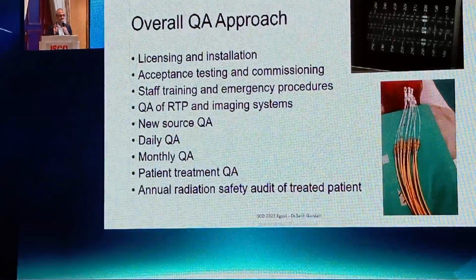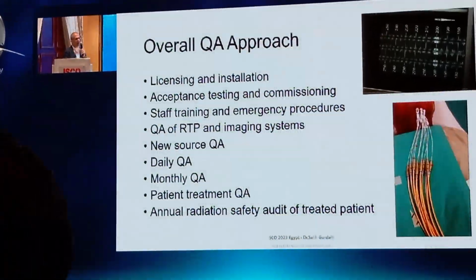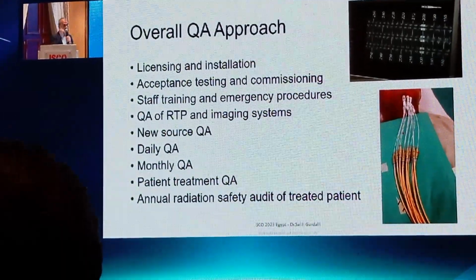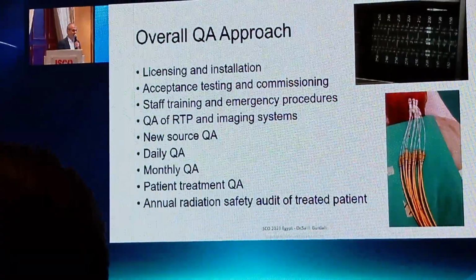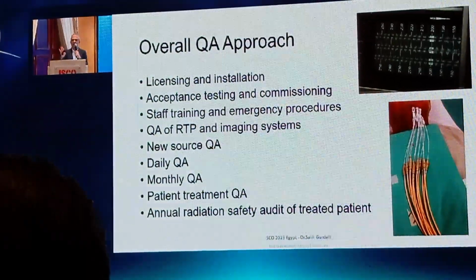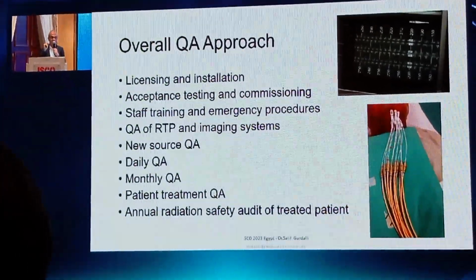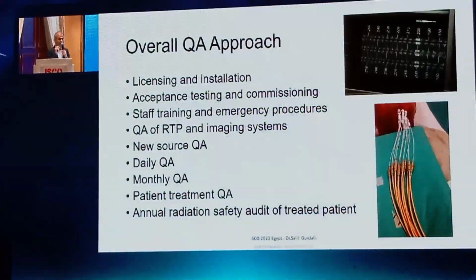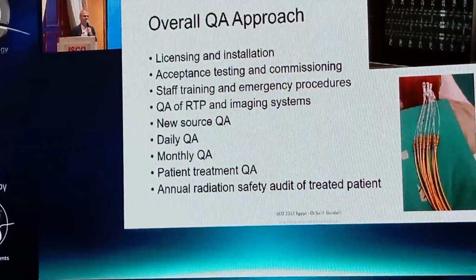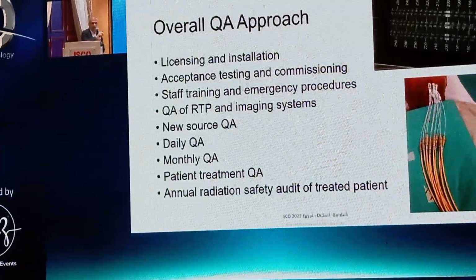How is the patient QA? Are we going to measure the dose every day? There are different concepts for the patient QA, like checking the applicators and the connector cables. I strongly recommend to organize somebody to check them every fraction. If one line goes to the other one, even if the picture on the screen looks perfect, that is a misadministration. Please check the misadministration on the internet. Most of the issues come from the calibration and the wrong patient treatment because of the misalignment of the catheters. So everybody has to be sure number one goes to number one, number two goes to number two.